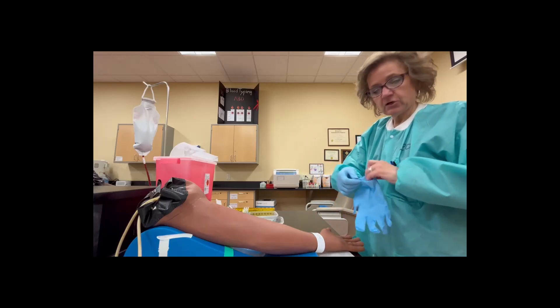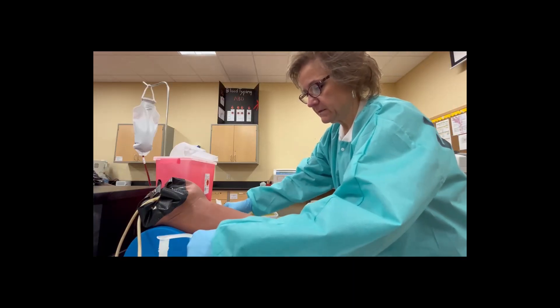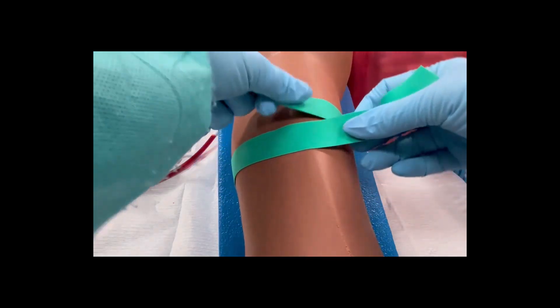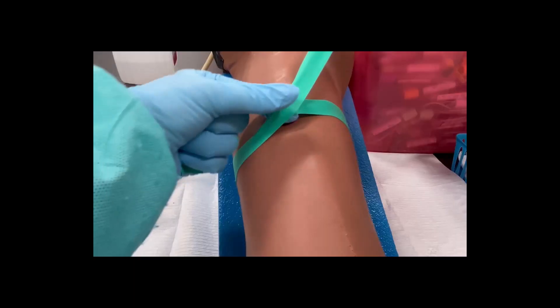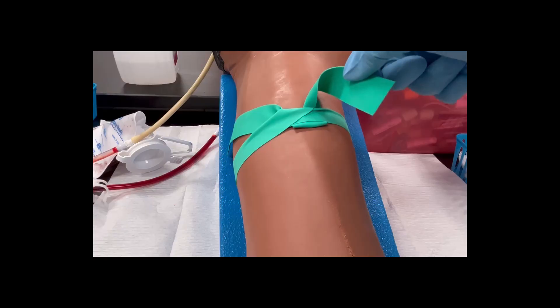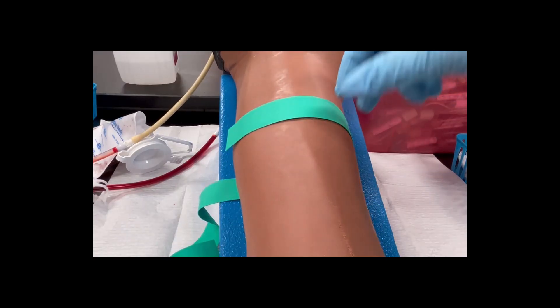I'm going to start looking for that vein and tie my tourniquet. When tying the tourniquet, I take the band, switch hands so it's crossed, then stretch and tuck it in at the top just a little bit. That way when the phlebotomy is done I can grab the end piece and pop it up, and the whole thing just opens up.